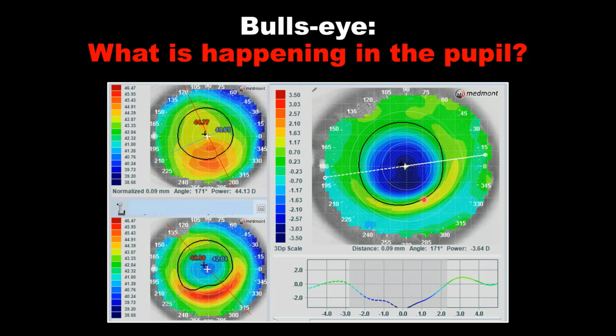We've talked about the analysis within the pupil and how it shows up on the graph down below here. So let's focus in on this area. And what you see is the most minus effect on the fovea. But you'll notice that the shift that the orthokeratology lens creates is causing a drop in effect as you go away from center. And this is actually desirable in myopia control. You notice from our most minus to our most plus or least minus, there's a 3.62 diopter shift in the power of the eye. That can kind of be seen on the analysis here. You have most blue in the center, then you have green here at the pupil border, which is essentially 0. So this patient has been given by you a 3.62 diopter add.